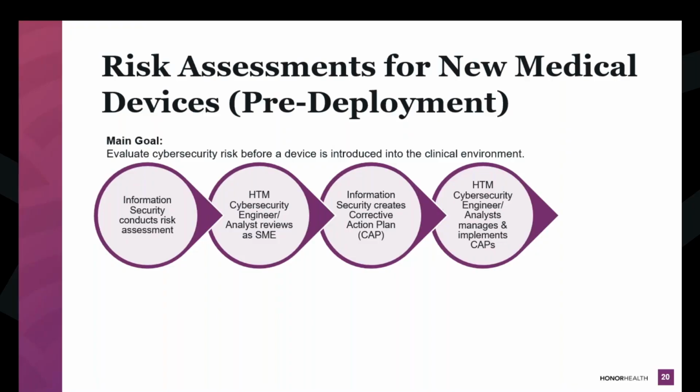And then for HTM, especially in the cyber role, they then manage those CAPs, those corrective action plans, to ensure that they get implemented. And then we work with the clinical leaders to make sure that there's an ongoing operational process, right? A lot of the time when we think about imaging equipment, some of them just store pictures until they run out of space. And then we go in, right? So the machine is not working. I can't save anything. Okay, so then Biomed goes in, deletes all these records because they didn't need to be on there in the first place. They're already in PACS. There's no reason to keep them on there, right? But we're keeping all this patient information on these devices.